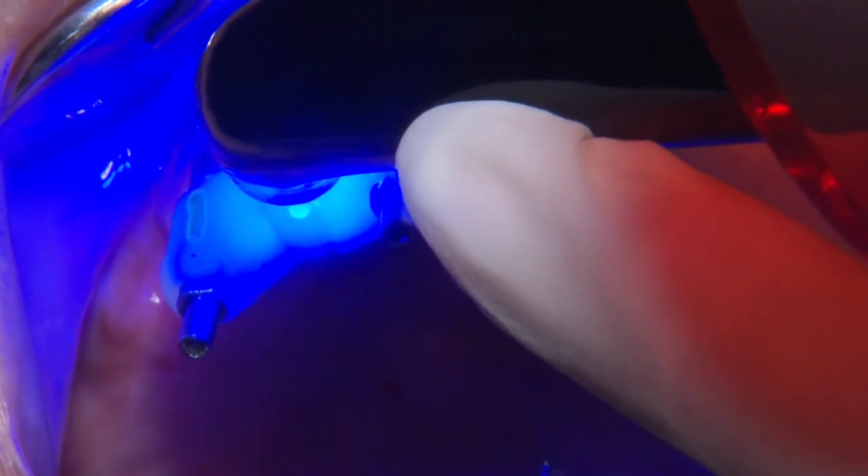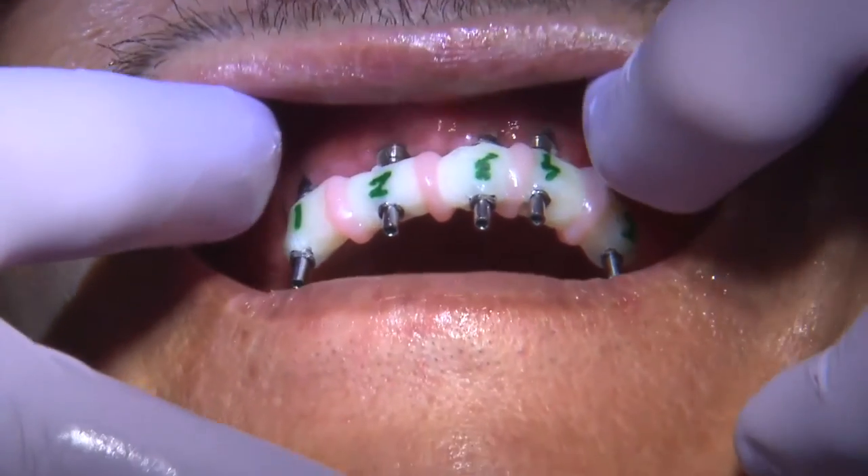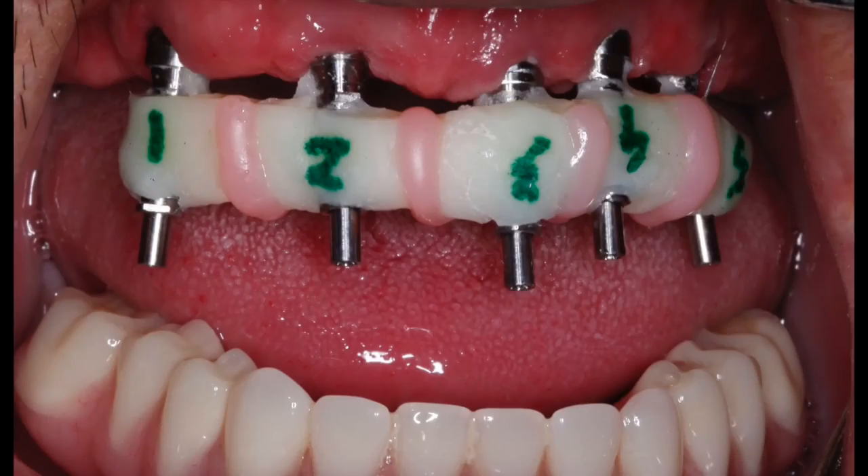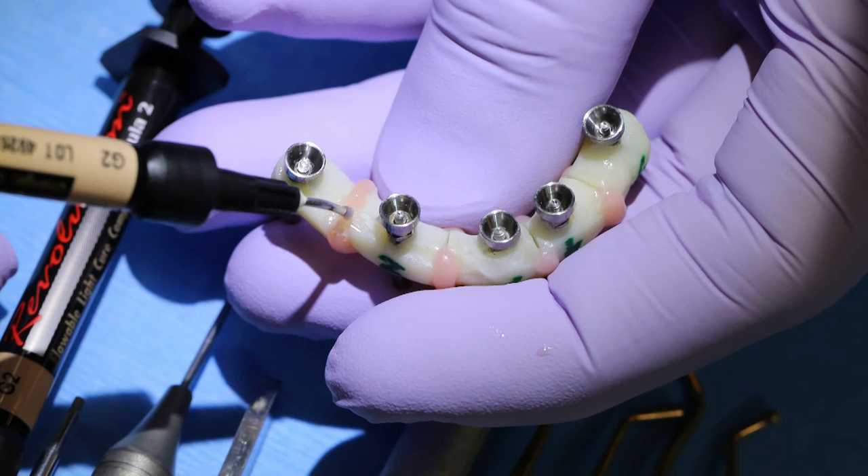Once all the pieces are connected, I'll remove the jig from the mouth to ensure it is one solid unit, and I can fill in any voids if needed. The underside was a little difficult to access, so I fill in some voids — but you have to take care not to go all the way down to the tissue level, because that's where your impression material is going to go.